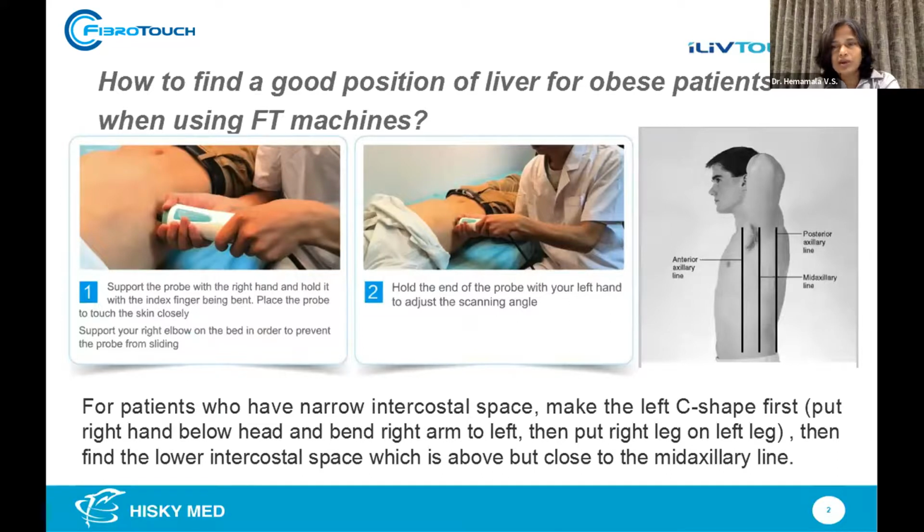The patient is obviously cirrhotic, but sometimes I don't get proper values in cirrhotics. Is it like the liver gets shrunken? Does it move far away from the rib cage? Sometimes I don't get proper values if the patient is obviously cirrhotic with a real shrunken liver sometimes.